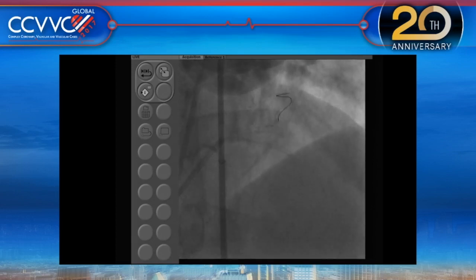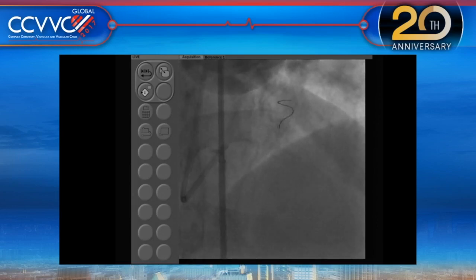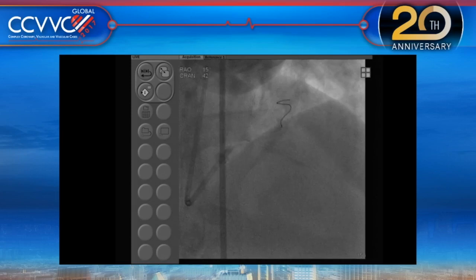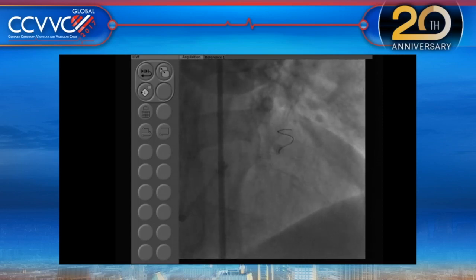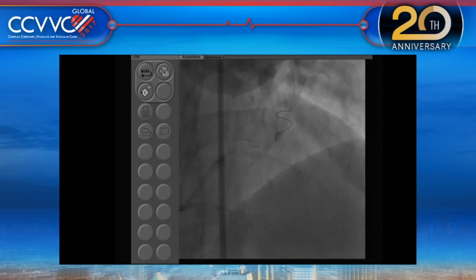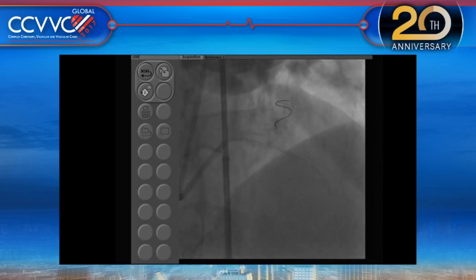Okay, now give the balloons. Let's do the ostial circ first, because we need to do that even if we plan to do a rotablation of the LAD. So this is the first thing we are doing. The Fielder wire is back. We have the Fielder wire to the circumflex. We took the rotational atherectomy wire out, and then we have a Runthrough in the LAD. We have IVUS ready also. Anytime we feel like it, we are ready to do the IVUS run.